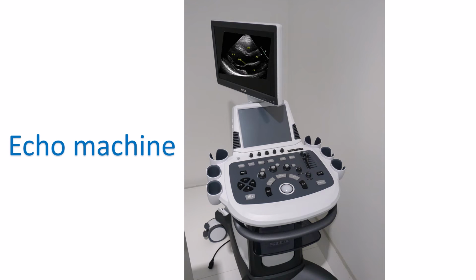Echo test is usually done with the subject slightly turned to the left side so that the heart becomes closer to the chest wall. Most of the interpretations are done by visualizing the live images, while some may require close scrutiny of frozen images. Both still images and cine loops may be stored in the machine for future retrieval. ECG leads may also be connected to get signals for timing along with the echo images. ECG is the electrical recording of the heart.